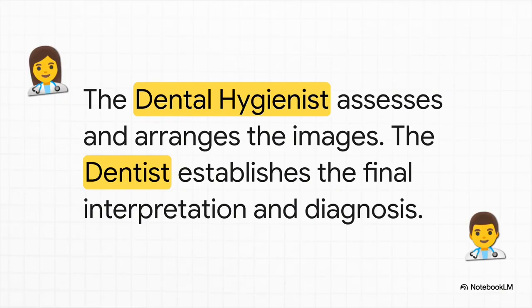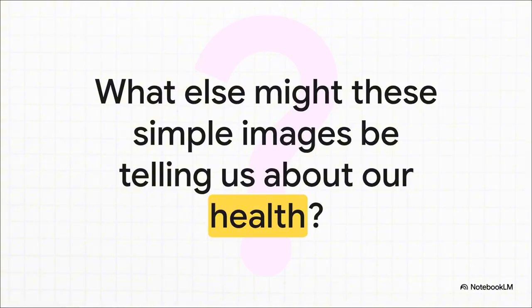You have the dental hygienist, who's the technical expert, right? They're the ones taking the pictures, making sure they're clear, putting that whole puzzle together. But, and this is the key takeaway, it's the dentist who makes the diagnosis. They're the one who looks at all that evidence and says, okay, here's what's going on, and here's what we're going to do about it. And just like that, the journey's complete, all the way from a spark of superheated tungsten to a critical diagnosis.